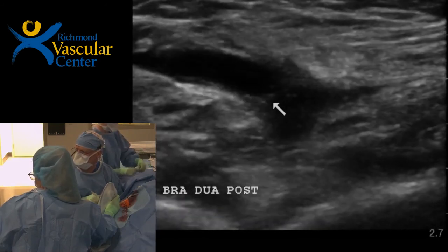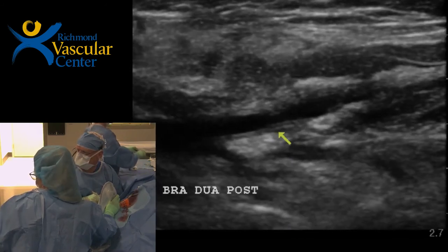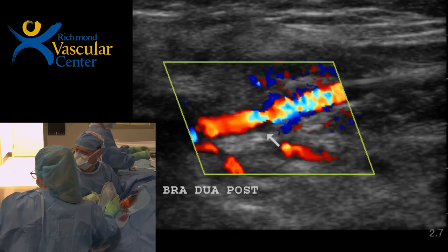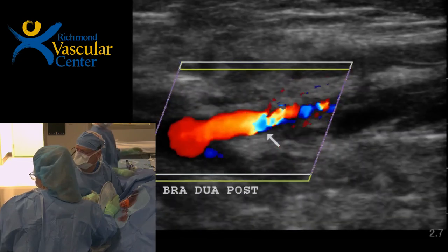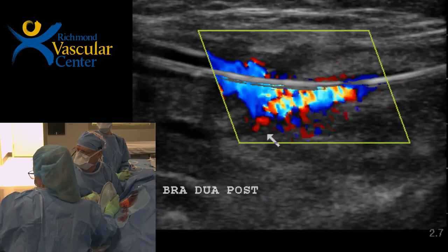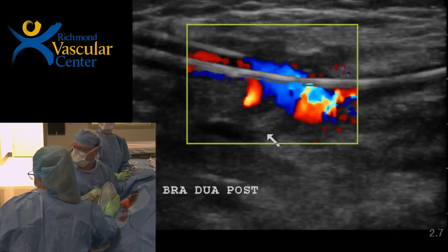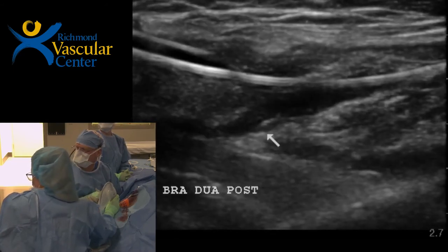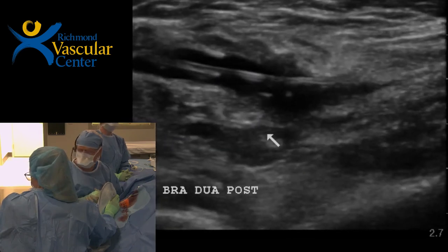How's the proximal radial artery? That sometimes goes into spasm, and you can see a little thickening and spasm there. With all this heat and pressure, that's not uncommon, and that's probably what's limiting the flow a little bit. Overall, still pretty good, though. What do you guys think? Brad, think we're done? I think it looks great. You're probably limited by the inflow. Yeah, I think we're done.